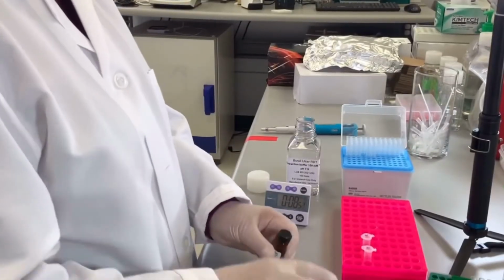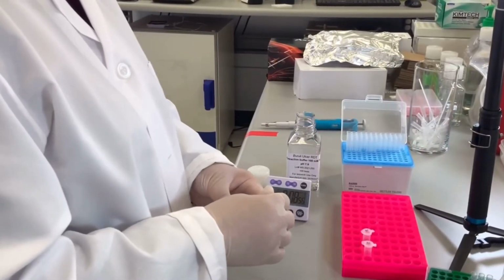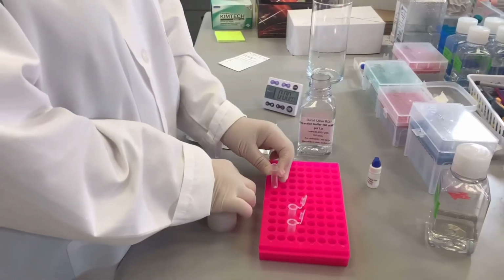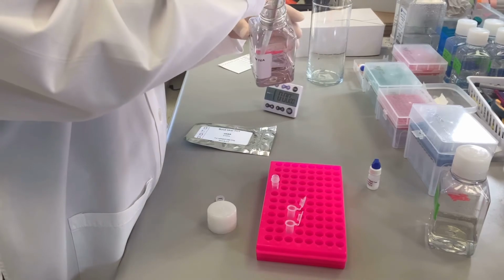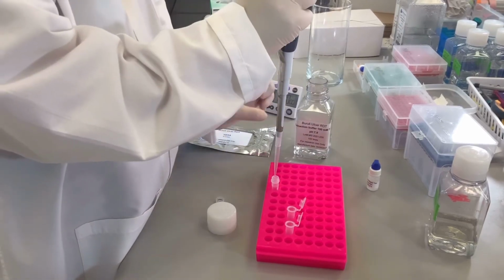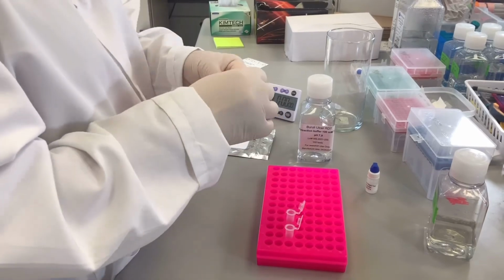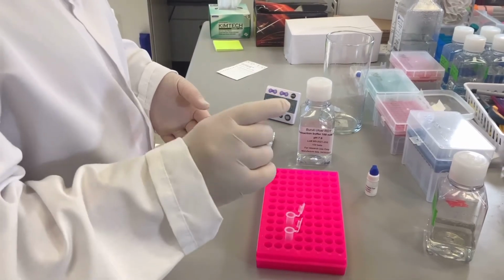Now, let's run the test with a sample. In our case, we use a simulated sample. Before you start the test, reconstitute a vial of HABA in 0.5 milliliters of TEA extraction buffer. This is enough for 10 tests. Mix and let it reconstitute for 10 to 15 minutes.